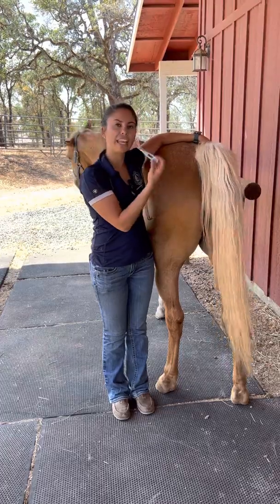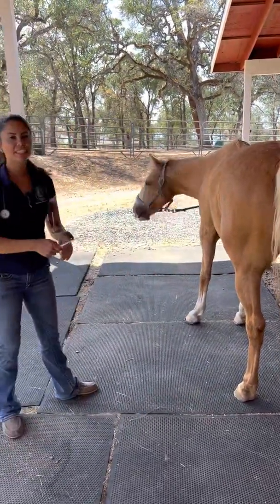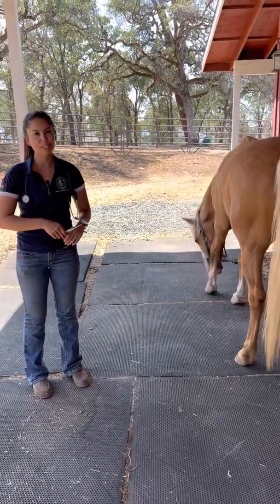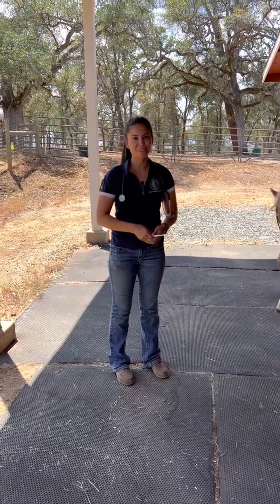She's 98.8. Very normal. Good girl, KT. So those are just a couple of things that you can do on your horse if you feel like you're experiencing an emergency. And if you tell us those things, then we can better advise you. Thank you.